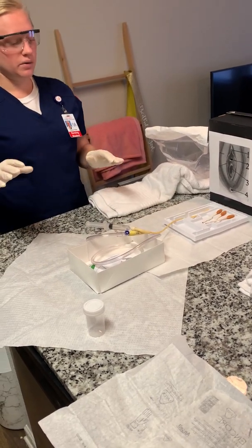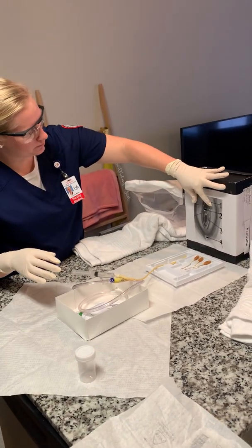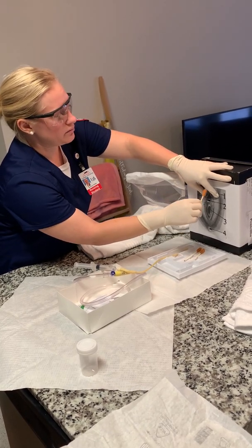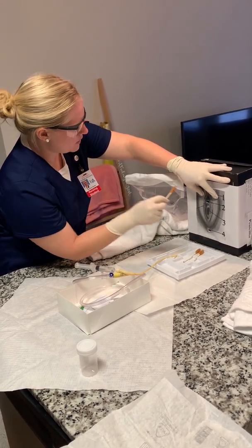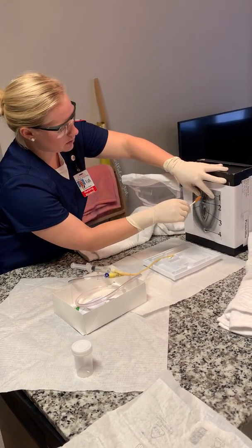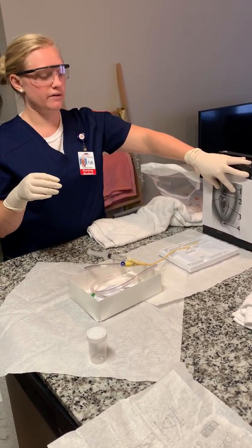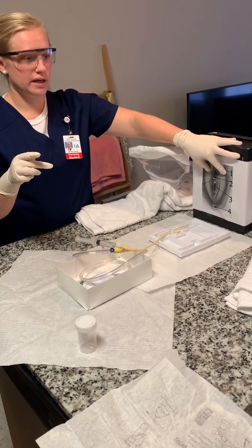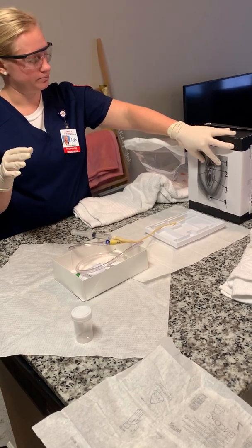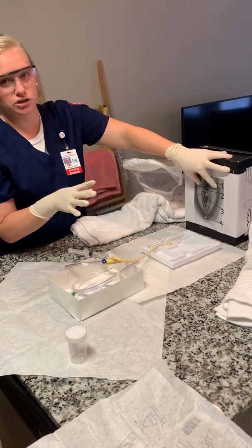Okay, so now I'm gonna perform perineal care for the female. So I'm gonna open here, take a cotton swab, starting at the left labia, go front to back, here, down, start to the right labia, front to back, down, and in the middle, front to back, down. And then for a male, I would hold the shaft of the penis and clean from the tip to the glans penis in a circular motion. And I want to make sure I keep this open so I don't break sterility.